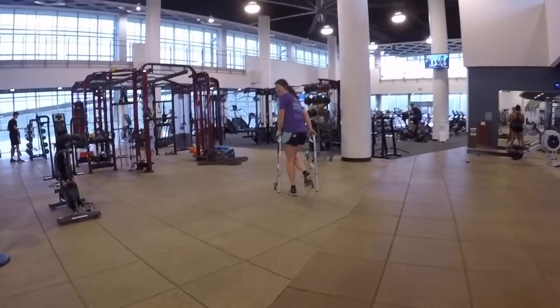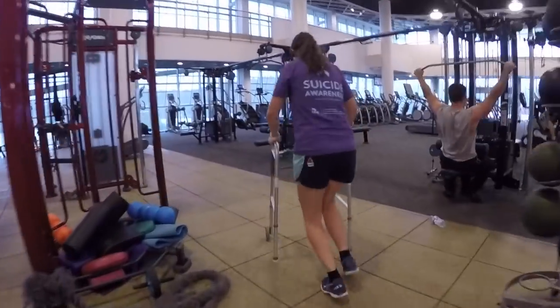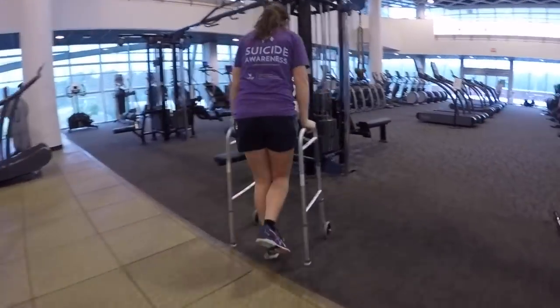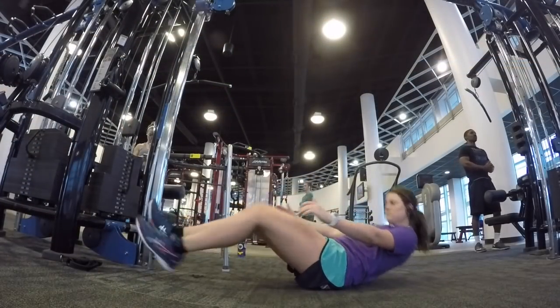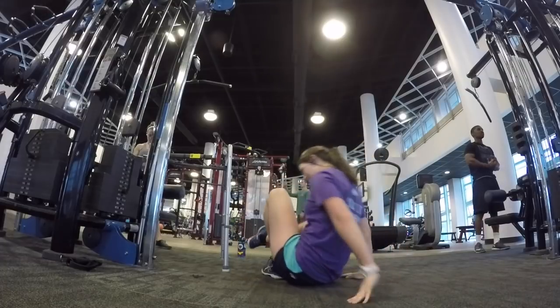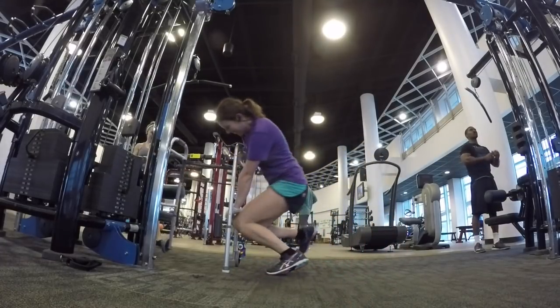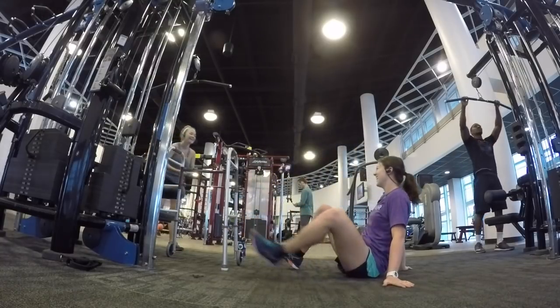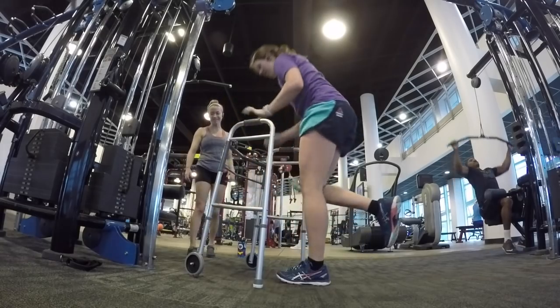I grew impatient, so I started hopping quicker to speed up this process. Getting up took a lot of effort, and at first I fell. For a patient, this fall would have been very harmful. The second time I got up was much better, as I learned from my previous fall.